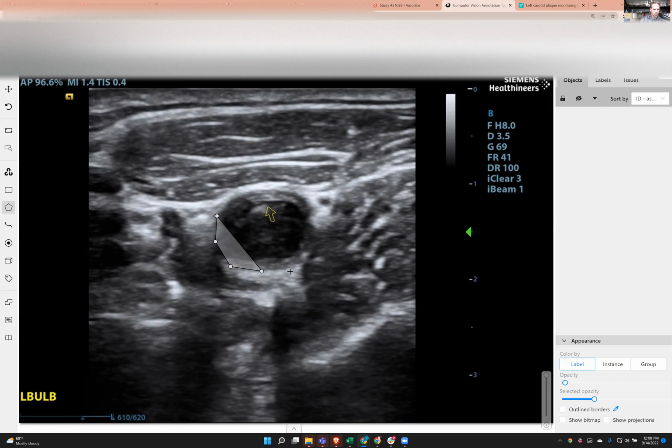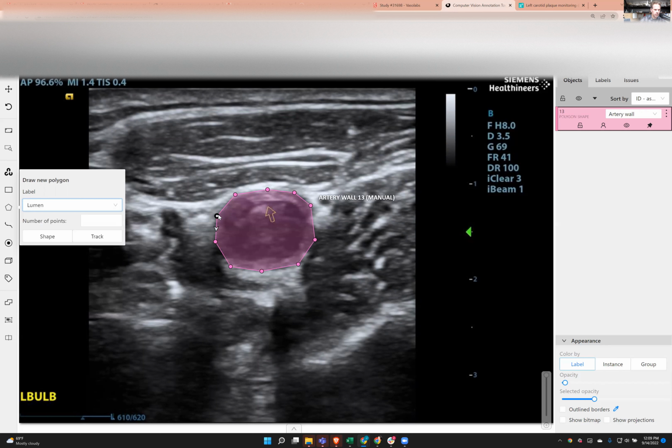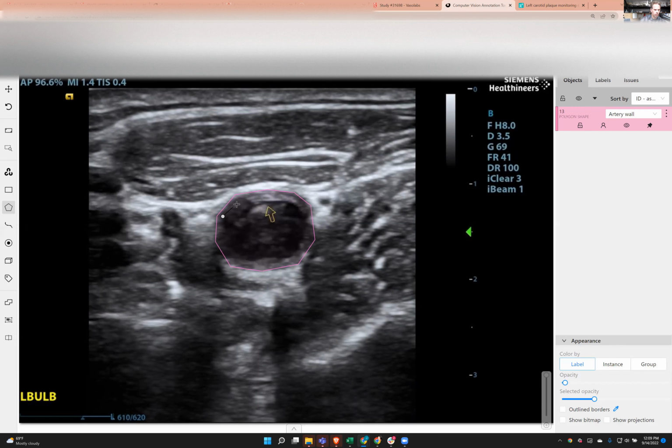This is some inflammation in my artery. It's in the right or left bulb. You can see the outside. Let's take a look at the inside. I've got some inflammation building in the walls right up here. Very clear. That should be super thin, like it's drawn with a mechanical pencil.